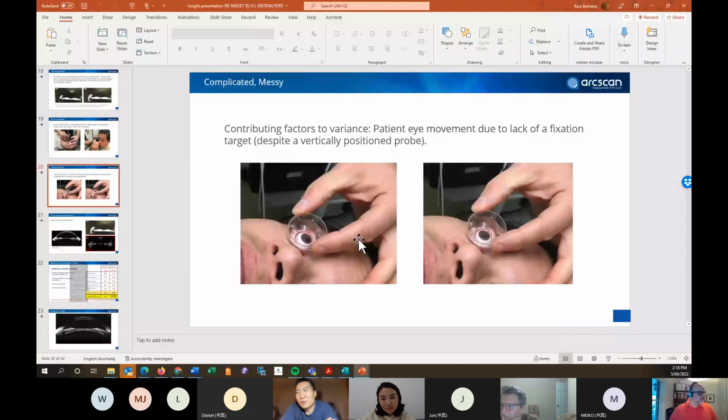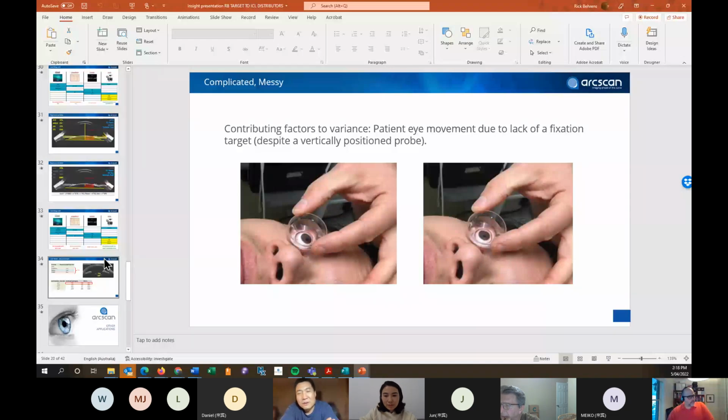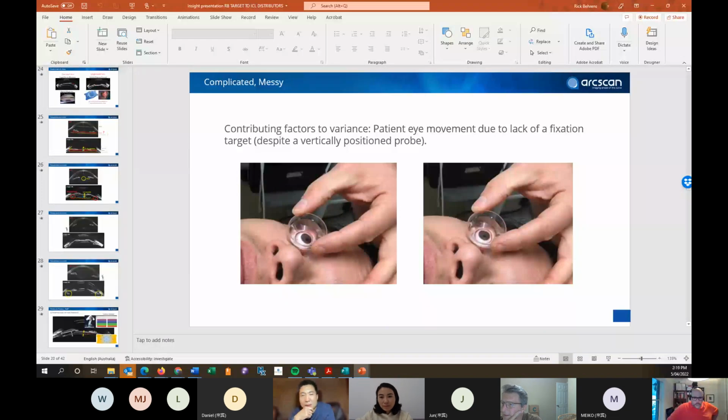If you want to focus on the lens, you can do the lens, and you focus on the anterior chamber, you can do the anterior chamber, or iris, or cornea. You have a limit. For each of the scans, we have automatic scans. Those scans are set up so that the focal plane is set. So for a cornea image, the focal plane will be set to the cornea; for the anterior segment, more at the iris plane; and for the ICL, off the anterior capsule. We automatically set the depth, but then you can go manual and change it if you wish. That's something good to know.